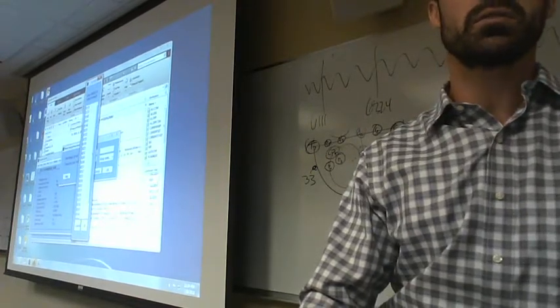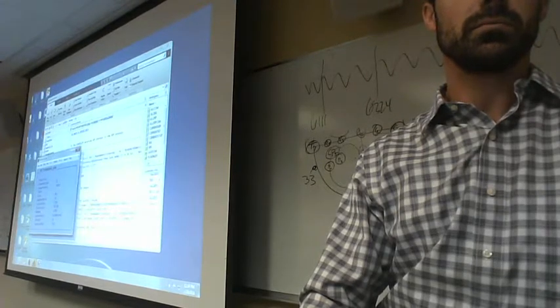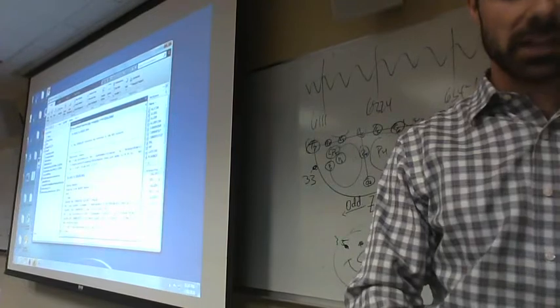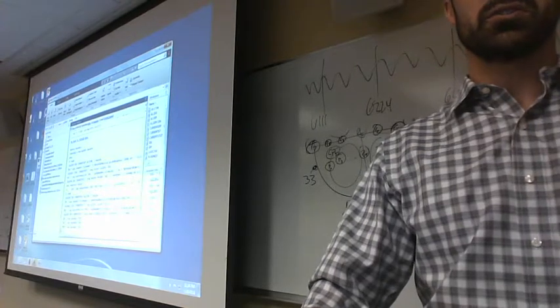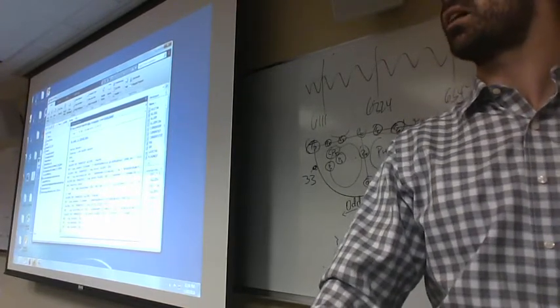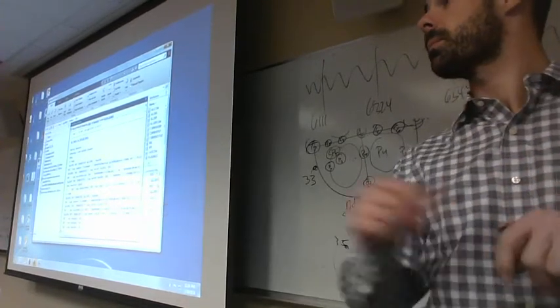Now what we can do is come back here, and you can even type EEGH again. It'll show you again what we did in importing that events list. You can put that into your script so that you remember what we did, and then you could paste that line that we just did underneath it to add it to your script. Yes, ma'am.